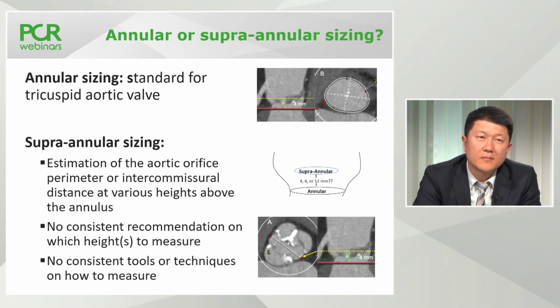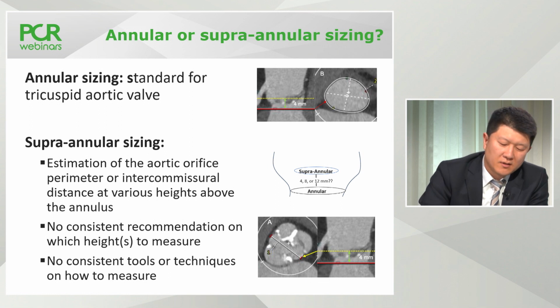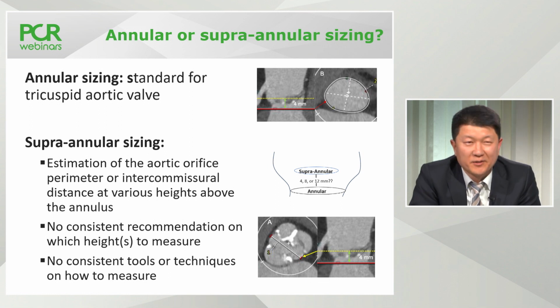So we've talked about diagnosis, and we've talked about how we distinguish the different anatomies and the improved sensitivity of CT compared with echo. What about using CT for sizing? Because choosing the size of the device is so critically important, and this is another confusing area for many people. So give us a simple guide as to how we use the CT scan to measure our devices. Yeah. A simple guide is difficult.